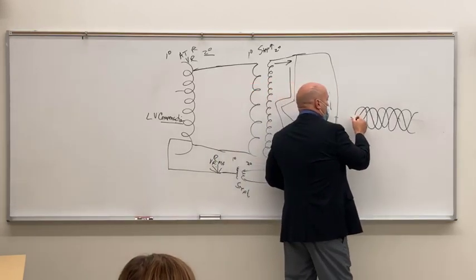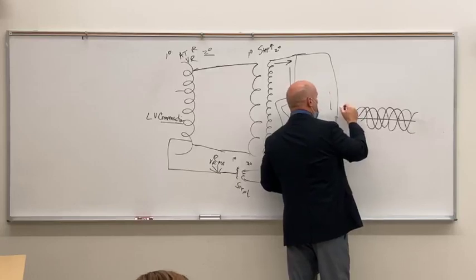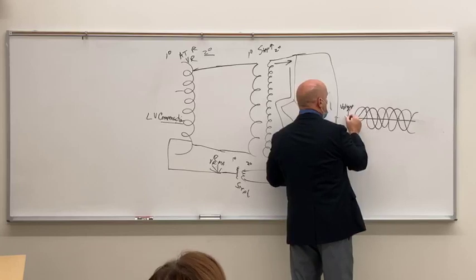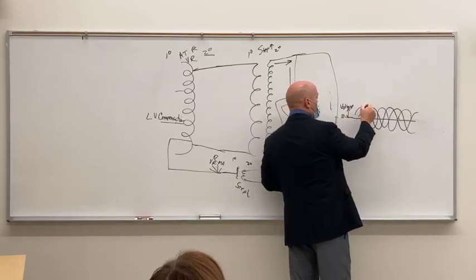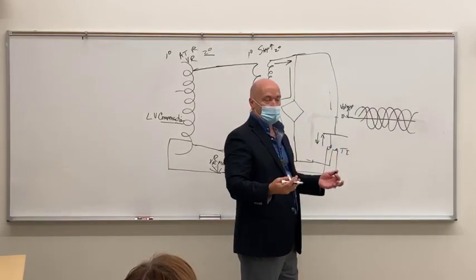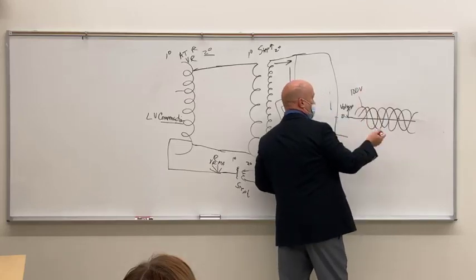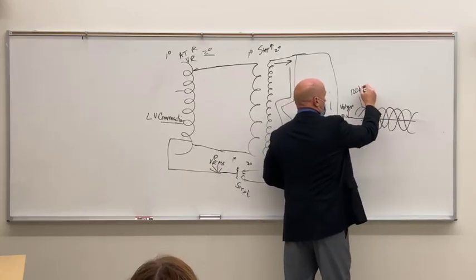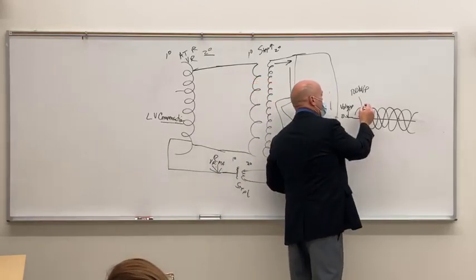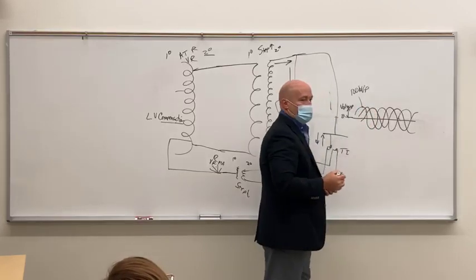So what this represents here is the magnitude of the voltage. At this point right there, we've got 0 volts. At the peak up here, we have the highest voltage that we have set. So if we have set 100 kilovolts on our autotransformer, 100 kVp, and our machine is shooting accurately, then that's going to be at 100 kVp.